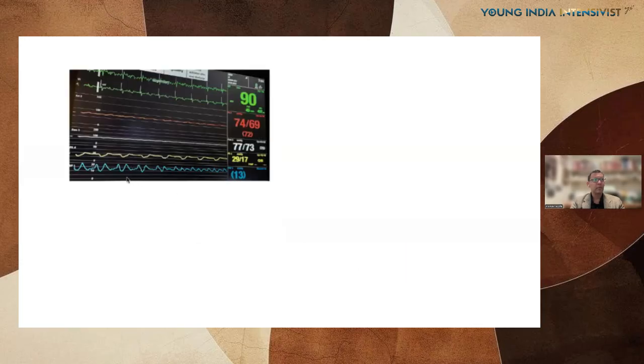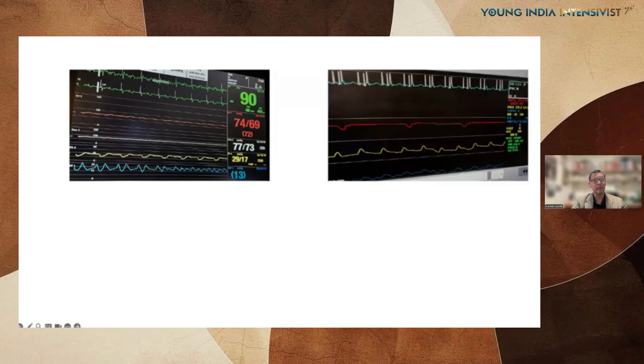Okay, a couple of other random examples. What is this patient? You've got a CVP, a PA pressure, and two arterial pressures. The arterial pressure is completely non-pulsatile. The PA pressure is somewhat pulsatile with each ventricular beat, and you see that there's some pacing here. This is a patient on ECMO. You've got some contractility reflected on the right side, in the CVP, and a little bit of variation in the PA pressures, but the arterial circulation is non-pulsatile.